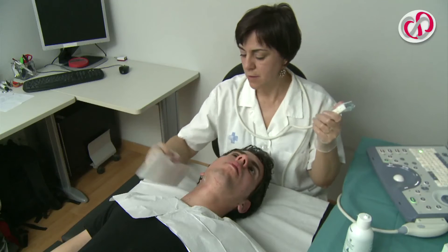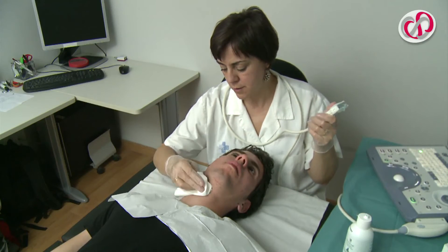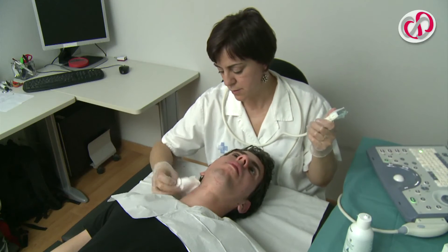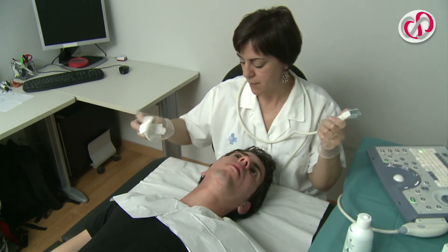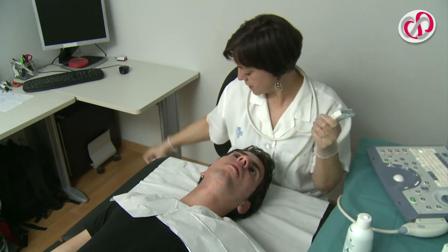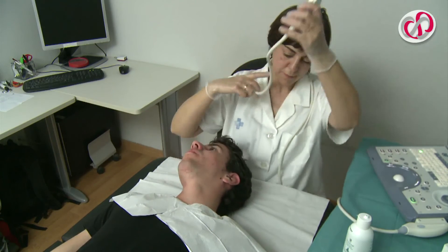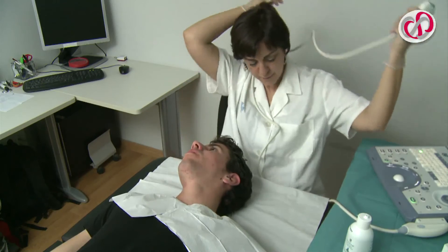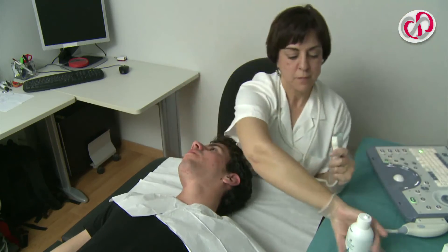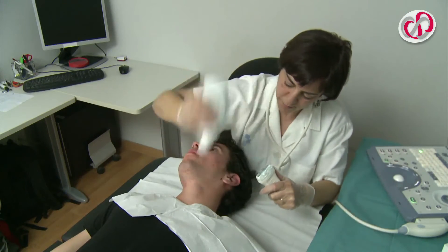The same procedure is undertaken on the left and right sides. After the examination, the resulting images are reviewed for accuracy.